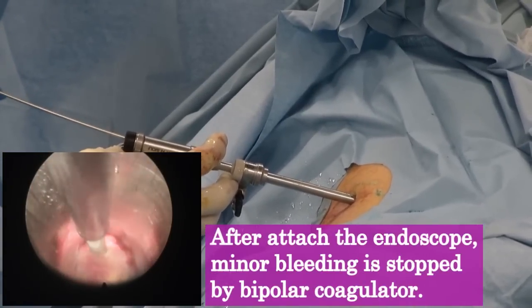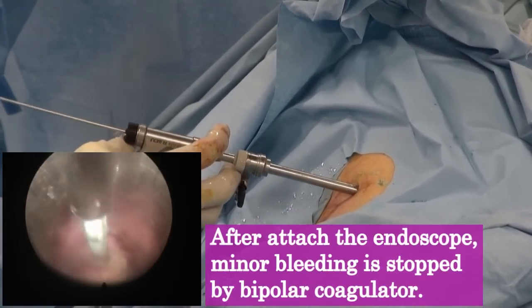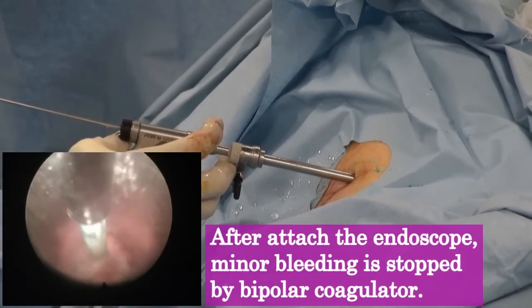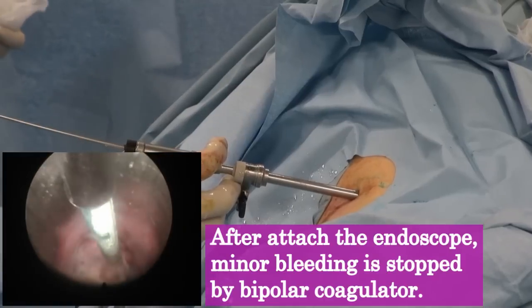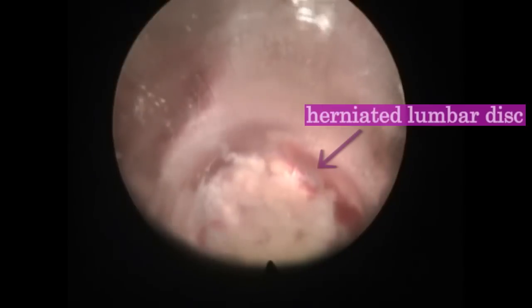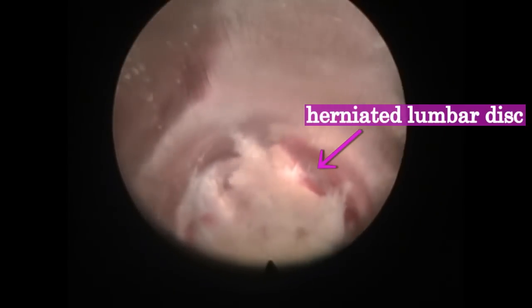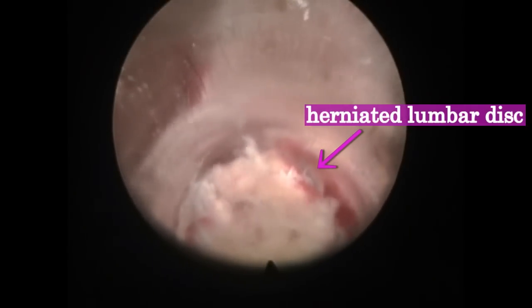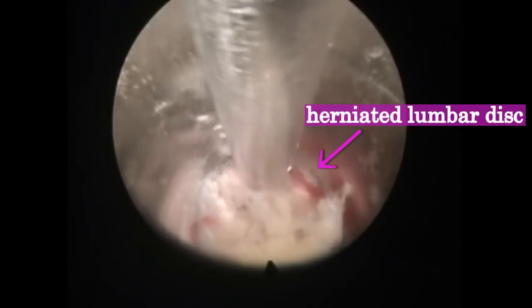After attaching the endoscope, minor bleeding is stopped using a bipolar coagulator. We can now see the herniated lumbar disc at the upper right corner of the cylinder.